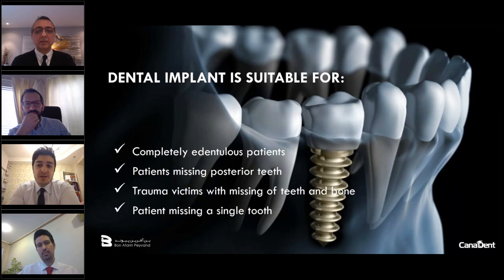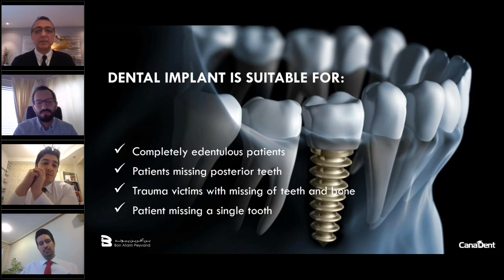Okay. Nowadays, dental implants have become one of the best treatment options for patients in need. Despite the high cost, the benefits that come with it are so significant that nobody can omit this option from their treatment plan. So what are dental implants suitable for? In the following slides, we will briefly review these topics which are mentioned in the slide. As you can see, dental implants are suitable for four major categories.